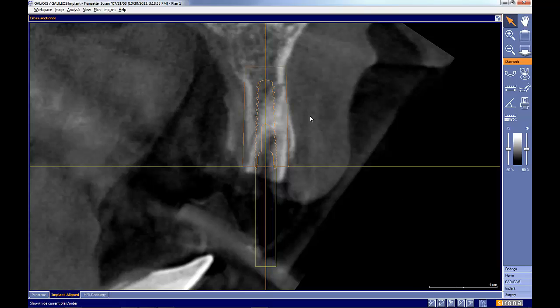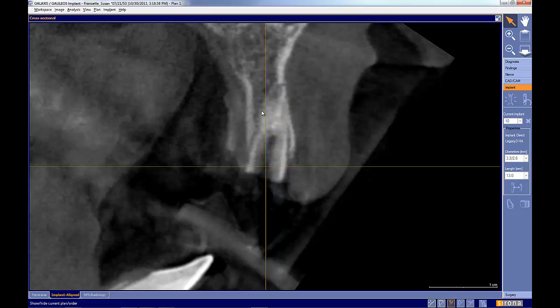We're here in the implant align view. This is the initial plan that has been sent to me. Let's take a look at what I'm seeing. And I want to back up for a second here. I'm going to make the implant disappear. I'm also going to go ahead and make my crosshairs disappear here as well, so I can take a closer look at, well, maybe the crosshairs won't disappear. I wish they would, but they don't look like they're going to. That's okay. I want to take a look at a couple of things.